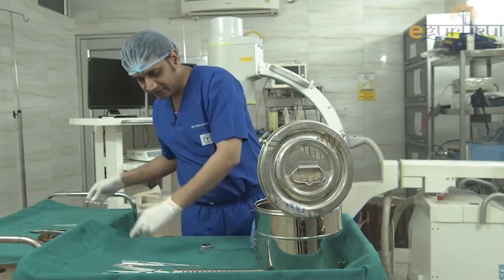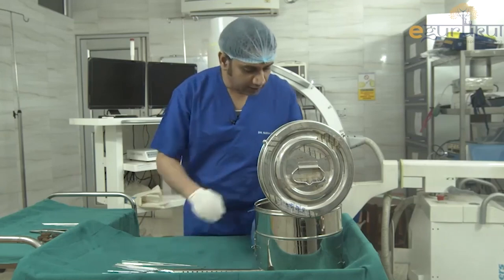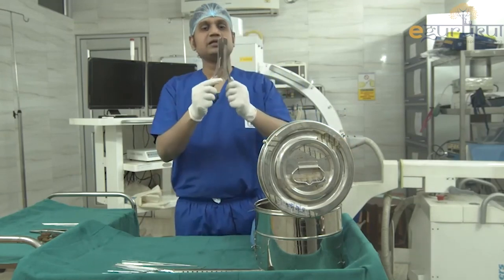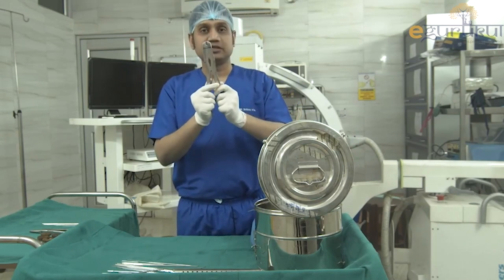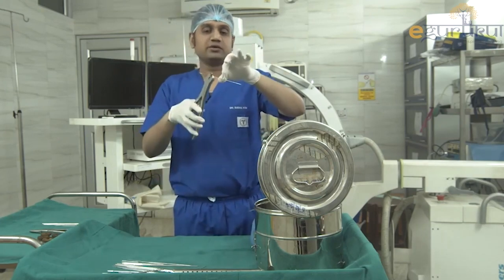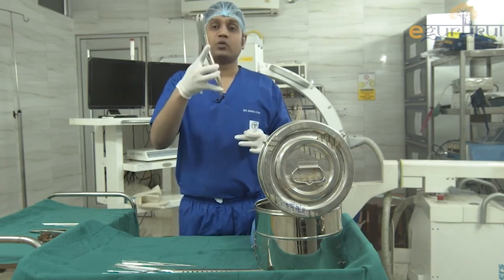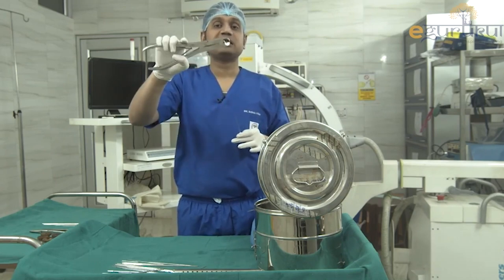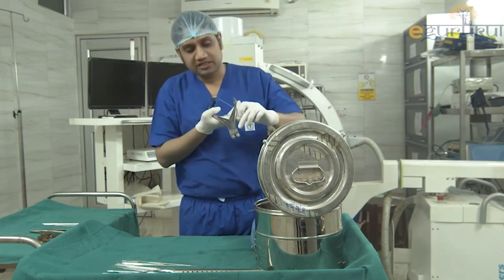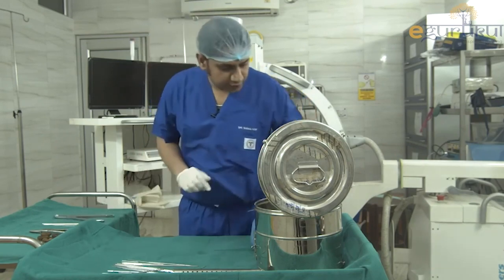So we have Denham pins, Steinmann pins, and different sizes of K-wires, plus the plier. Next is a wire cutter — you hold the wire and cut it. This cutter has very sharp margins and can be used for cutting multiple things, including wires and bone.